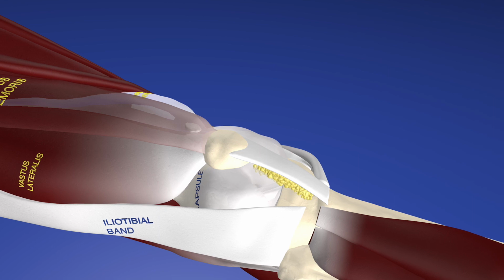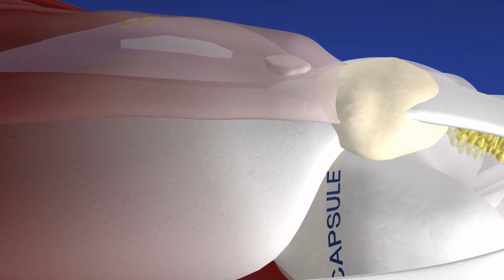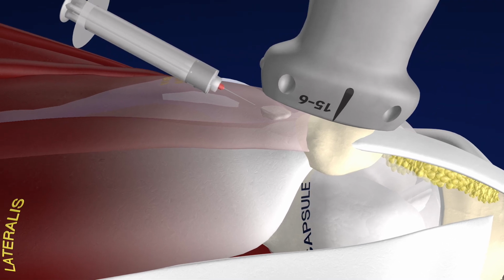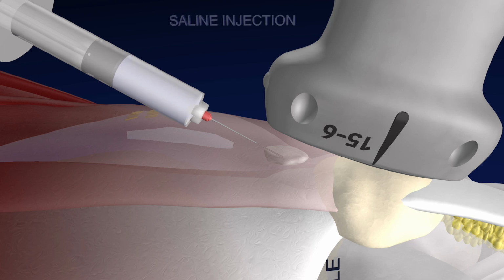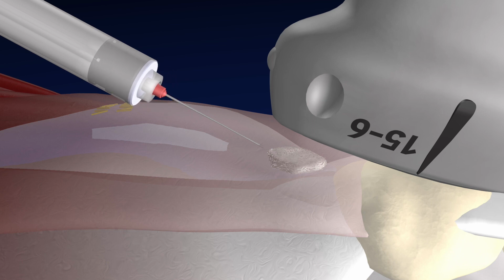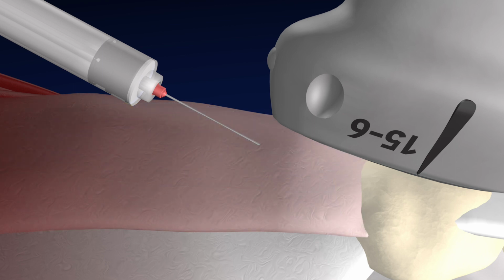So let's look at this in a little bit more detail, seeing the pertinent anatomy. Here essentially is the calcification within the rectus femoris tendon, which is somewhat translucent. And here we're initially injecting some lidocaine just superficial to it, and now we're beginning the needle tenotomy, trying to break up some of that calcification within the distal tendon. Here we're zooming in on that calcific body. Now we're injecting some saline as well into and around this calcific spot. You can see some of that calcium starting to get broken up, perhaps at a very small level. And here we're injecting cortisone as the final part of the procedure.